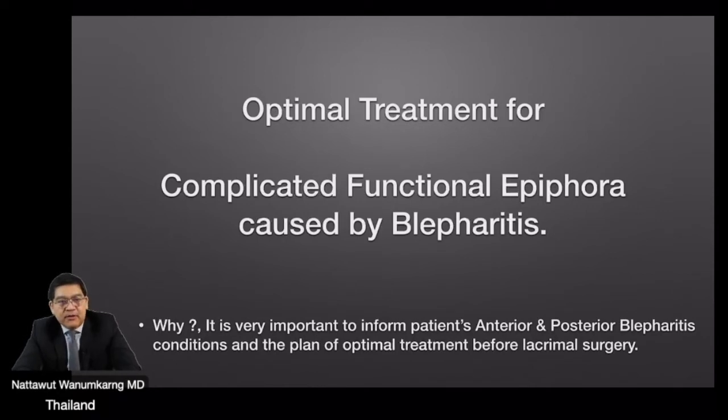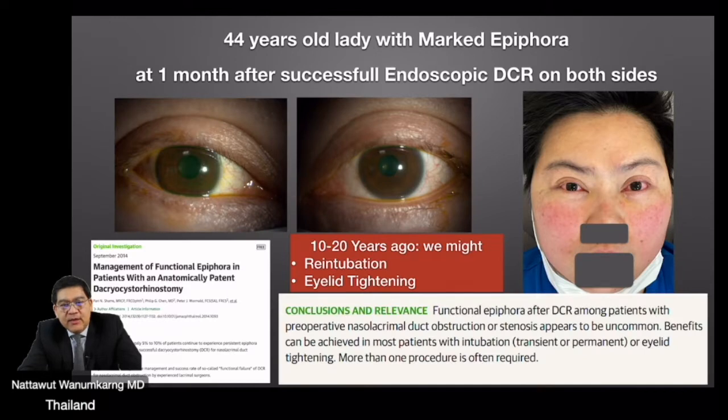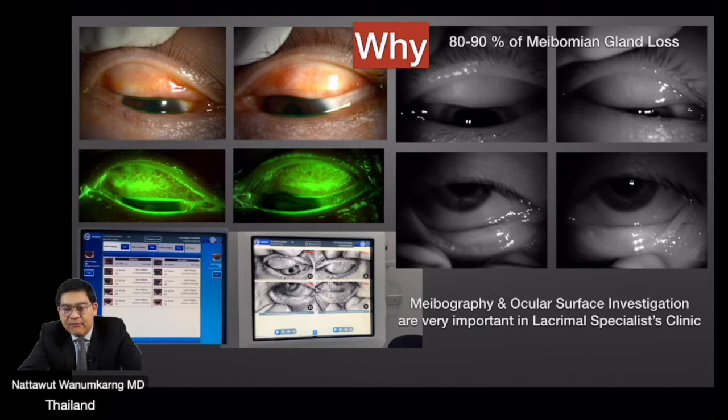For the second part of my talk, I will discuss the optimal treatment for the complicated functional epiphora caused by blepharitis. A 44-year-old lady presented with marked epiphora one month after successful endoscopic DCR on both sides. When we did the meibography, we showed that 80-90% of her meibomian glands had been lost.